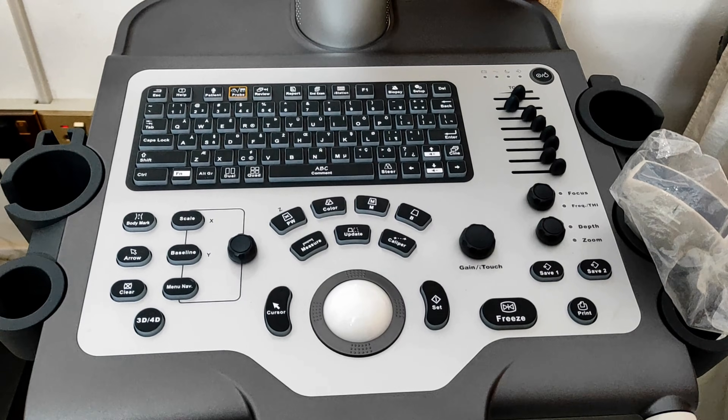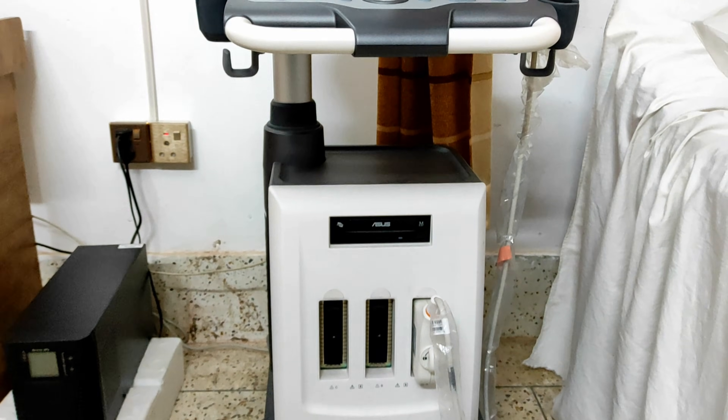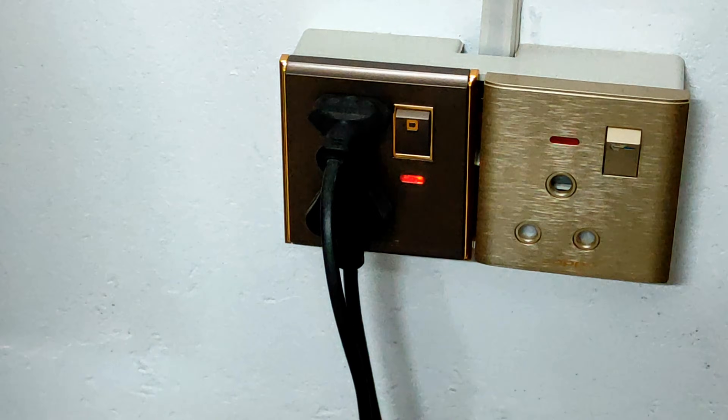In this tutorial I am going to tell you about the Mindray DC30 Ultrasound Machine. First, you have to press on this button where your machine cable is connected.